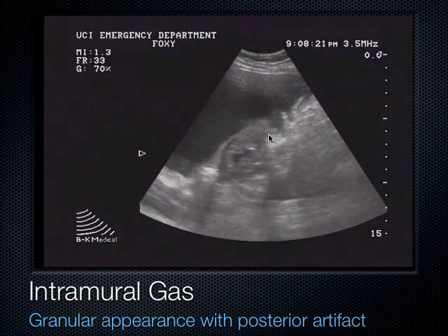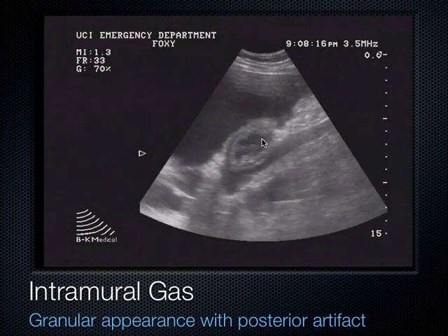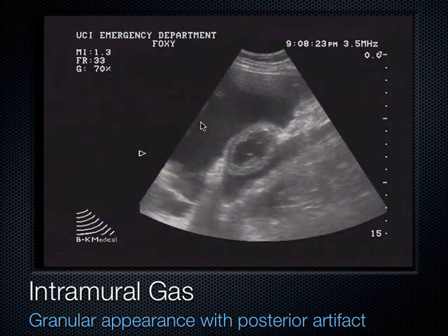It actually makes the intestines really easy to see. And this patient was really sick. They had some colitis here, and this thickened bowel wall plus this air in the wall of the bowel told us that this patient was very sick.